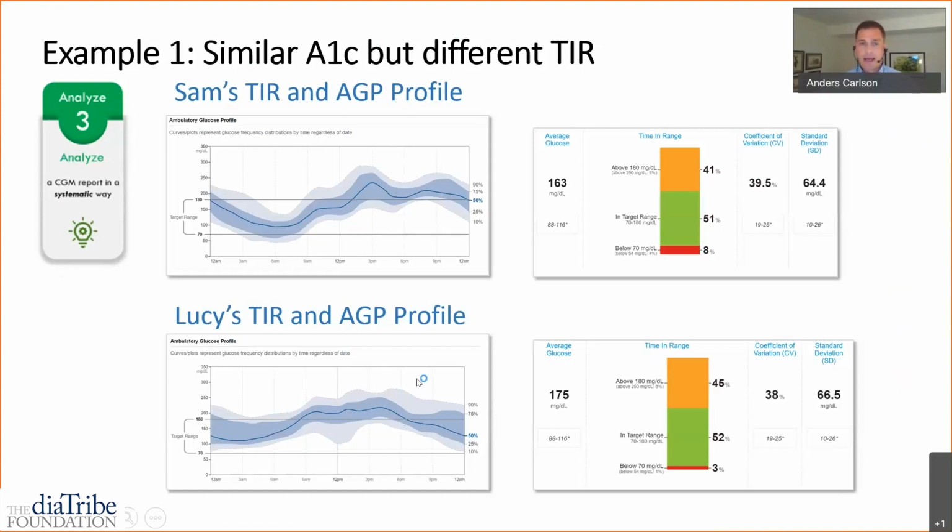And when I saw them back, they were doing a much better job at checking their finger sticks more consistently because of the observations we saw here. And with those changes, we were able to really bring both of them back down into target range, minimize their hypoglycemia, and the A1C actually came down a little bit as well.